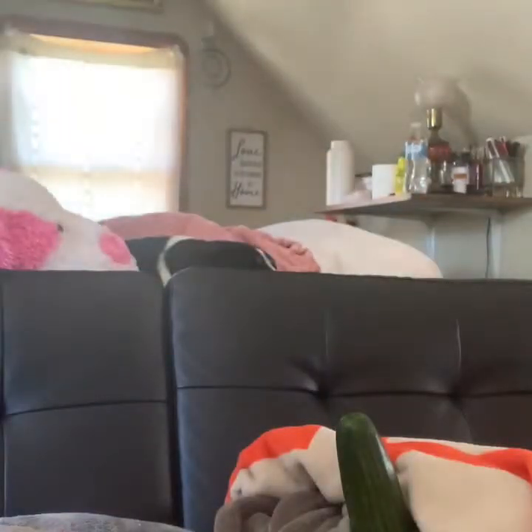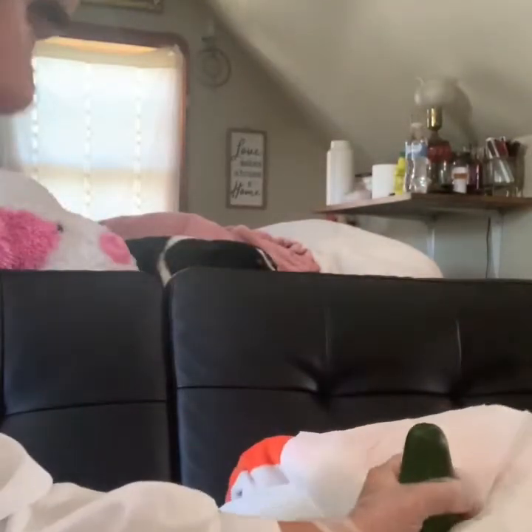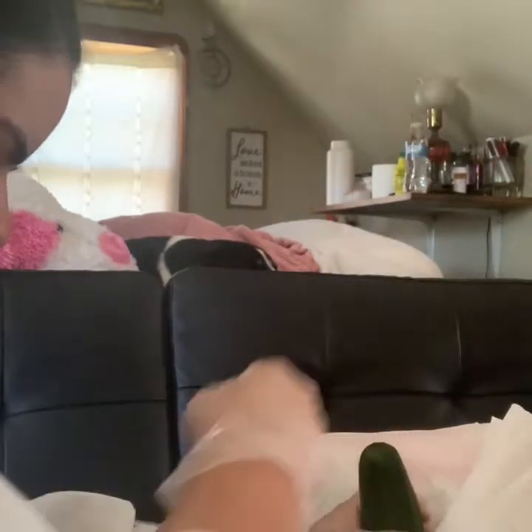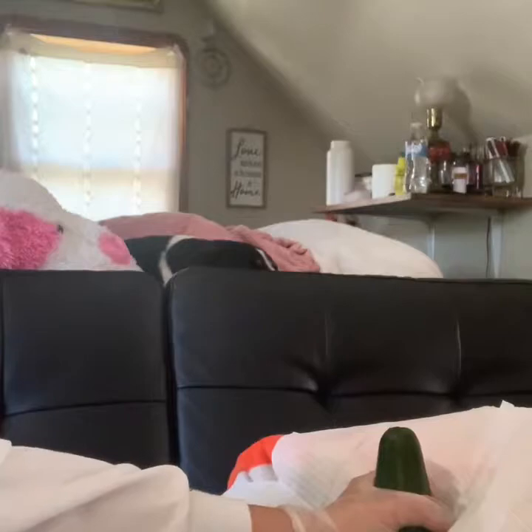So we're going to grab the drape — she said to put the shiny side down, so that would be this side. And then I'm going to apply the paper drape. I'm determining my left hand as my dirty hand because my dominant hand is my right hand. So I'm going to hold the penis straight up, use the first swab, do it around the top one time, and then trash that. Then go another time a little bit lower, and then one more time just a little bit lower. So now the tip of the penis is nice and clean.